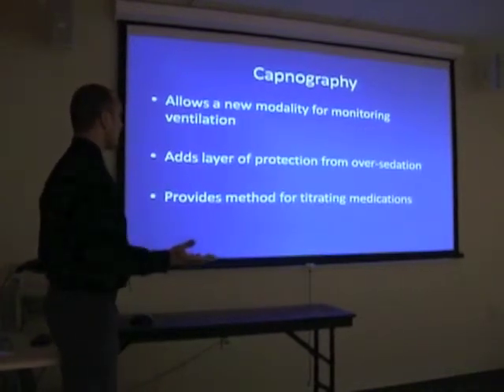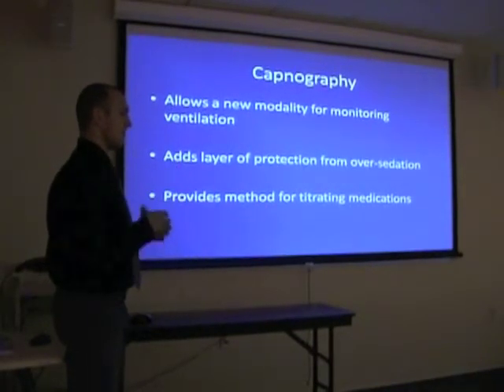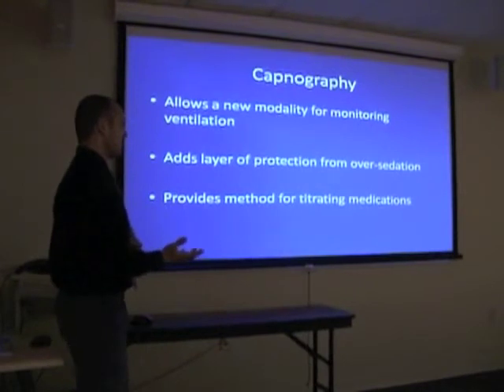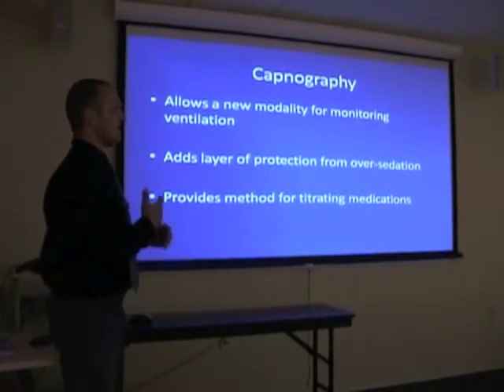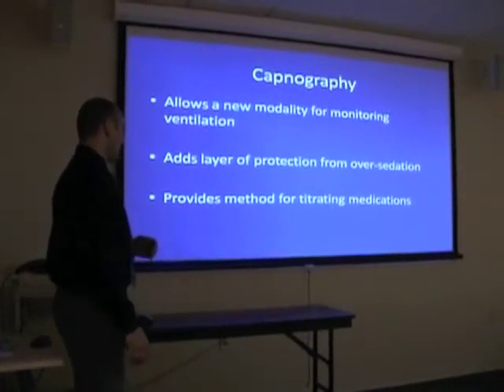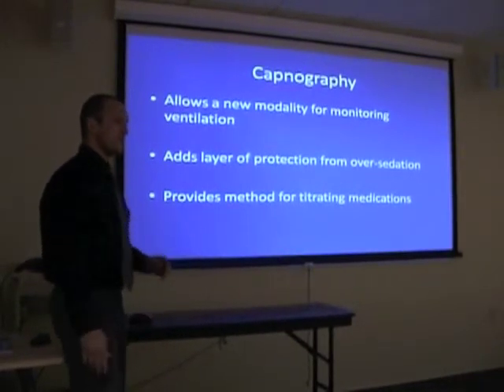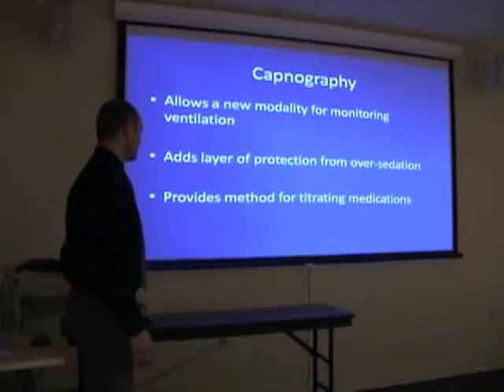So the nice part about capnography is it actually allows you to monitor ventilation itself. So you can actually see how well the patient's breathing. It adds a layer of protection for patients who are oversedated. It gives you a precursor to if they're starting to get hypopneic or apneic. It'll give you that information immediately. And then, we'll see, the nurses and yourselves can start titrating the medications based on how quickly the patient's breathing.